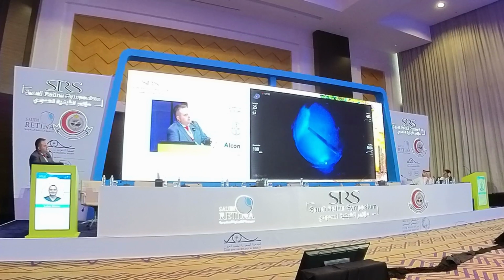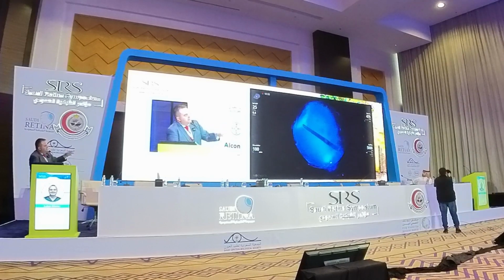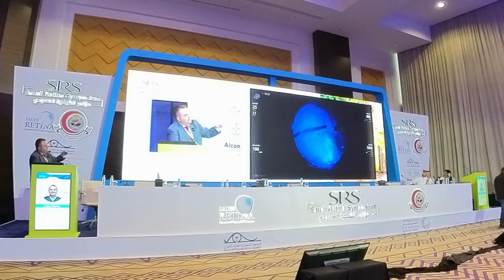Here is where the fluorescein is actually better than triamcinolone, which is the classical method of staining the surface of the vitreous. Here we have stained stroma, if I might say, about this tissue. So with indentation, you can clean all the vitreous inside the eye. It's debatable whether you should do it or not, but for the sake of visualization, you can see quite well where the stained vitreous is here. And the next step of the surgery would probably be ILM peeling.